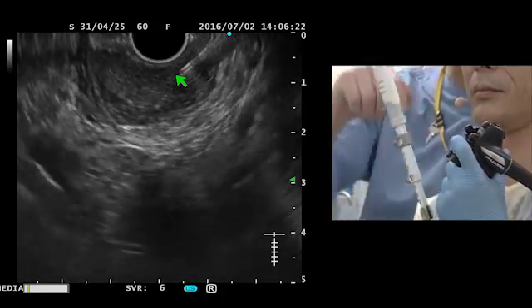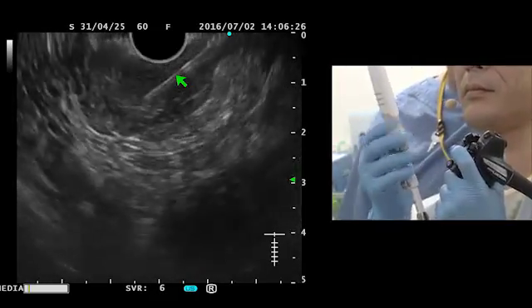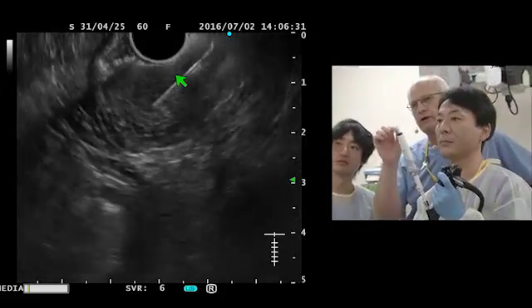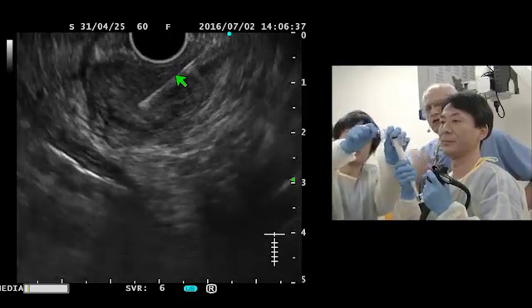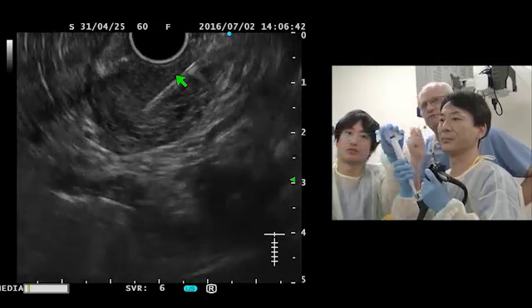You can see he likes to adjust the depth, and now makes what we say staccato, I don't know in Japanese, quick movements. Not slow movements, but quick movements in order to overcome the resistance. So staccato movements.